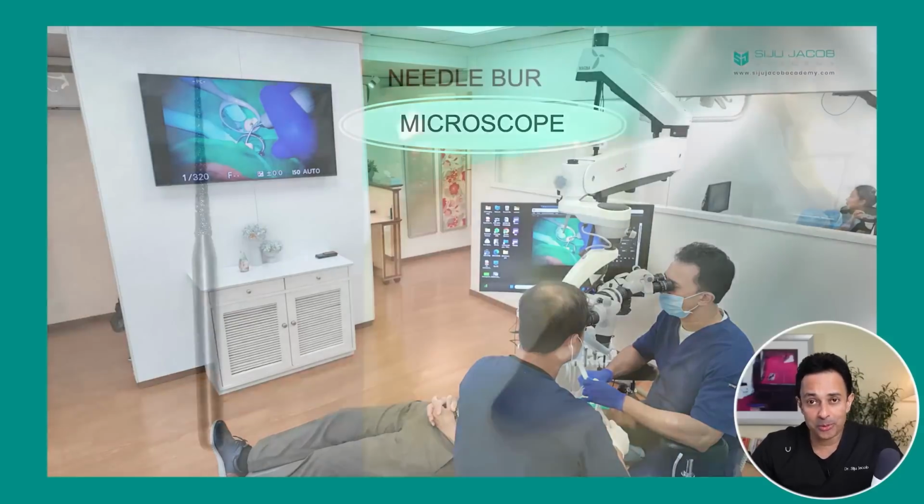And if you can get a microscope in your practice, then I think you can offer far superior care. It has a lot of advantages, and you should consider buying a microscope and putting it in your general practice. All right. So microscope, very important tool.